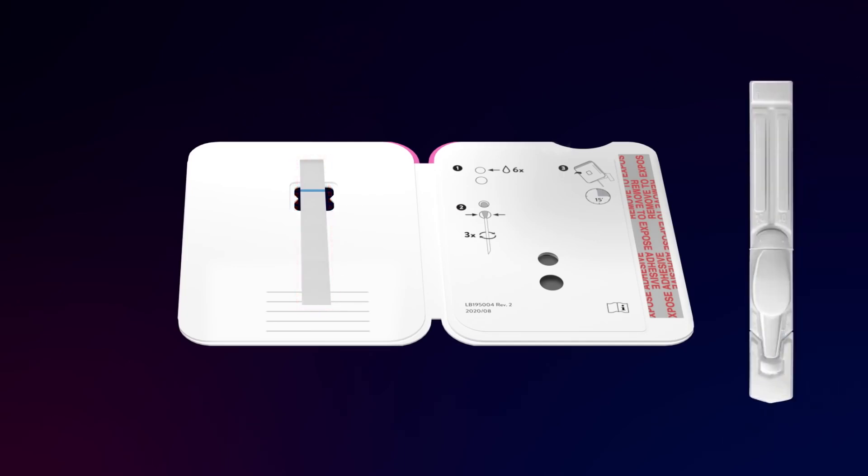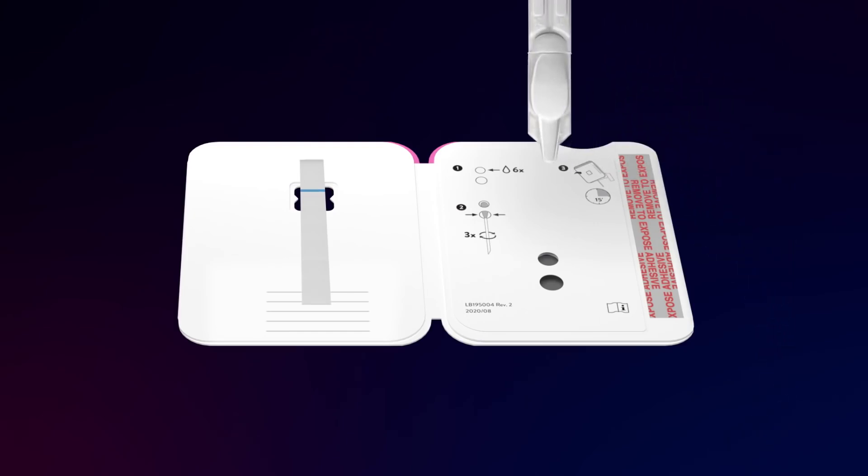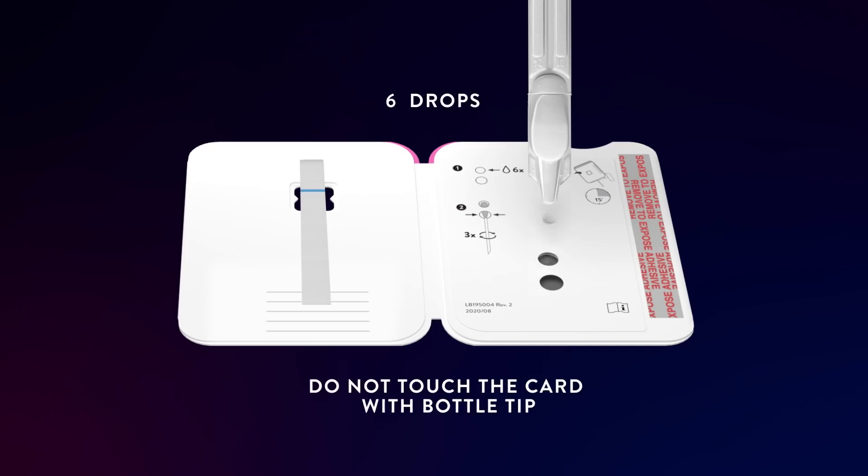Remove the dropper bottle cap. Hold the dropper bottle straight over the top hole, not at an angle. Slowly put six drops into the top hole. Do not touch the card with the bottle tip.